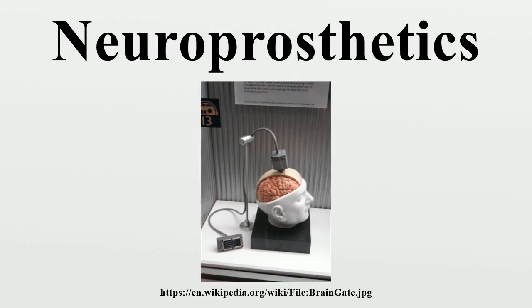Auditory prosthetics, cochlear implants, auditory brainstem implants, and auditory midbrain implants are the 3 main categories for auditory prostheses. CI electrode arrays are implanted in the cochlea. ABI electrode arrays stimulate the cochlear nucleus complex in the lower brainstem, and AMI stimulates auditory neurons in the inferior colliculus. Cochlear implants have been very successful among these 3 categories. Today, the Advanced Bionics Corporation, the Cochlear Corporation and the Med-El Corporation are the major commercial providers of cochlear implants.